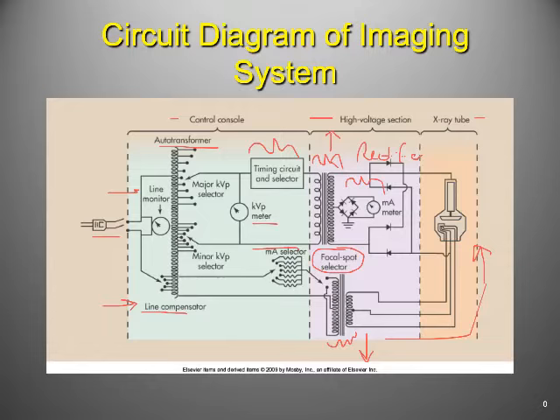So the alternating current now needs to be rectified. And if I come up here, when I talk about alternating current, I'm talking about a waveform that looks like this, right? This rectification system is only going to allow the electricity to flow in one direction.